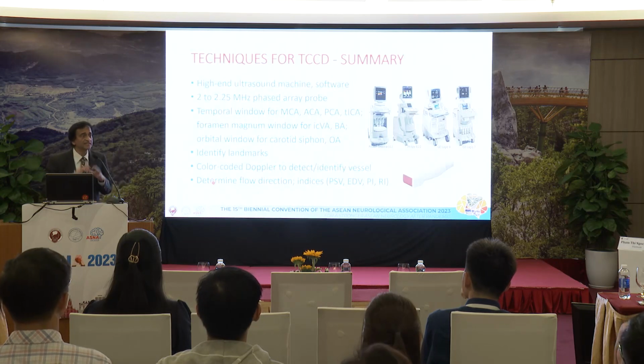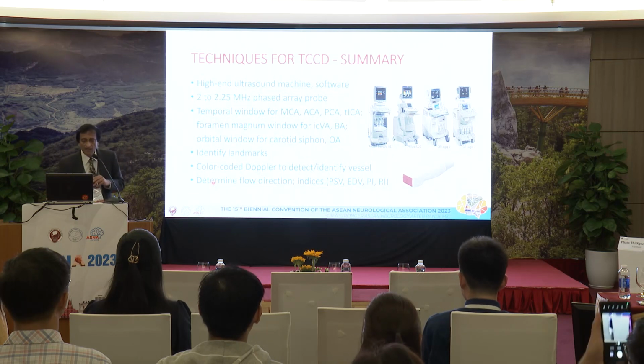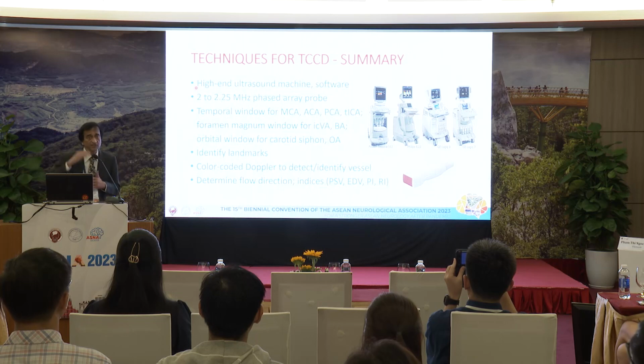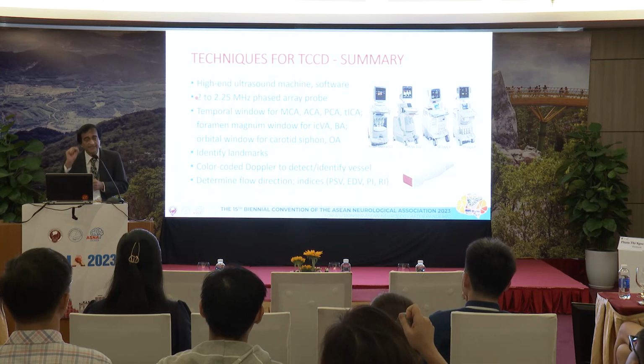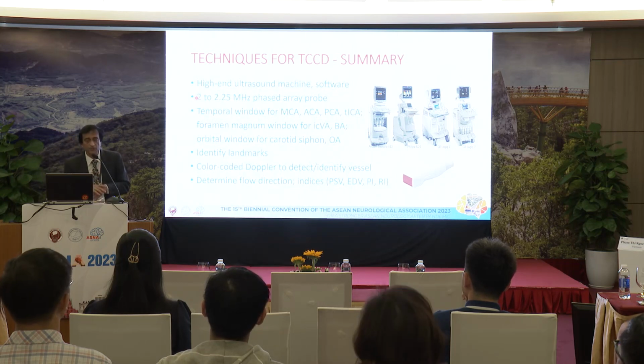The technique summary is in this slide. If you hear this slide, my talk is done. Firstly, you need a very, very good machine: high-end ultrasound machines, as you'll work with today, with the appropriate software to process imaging of the brain blood vessels. The probe is a low-frequency probe, as you've heard, to allow deep penetration into the skull.